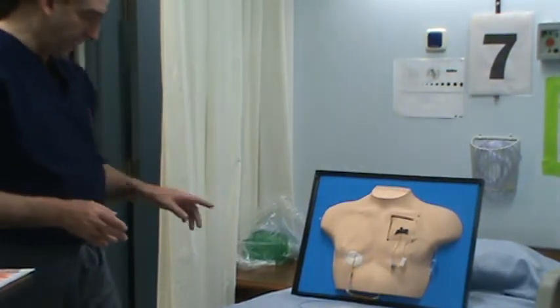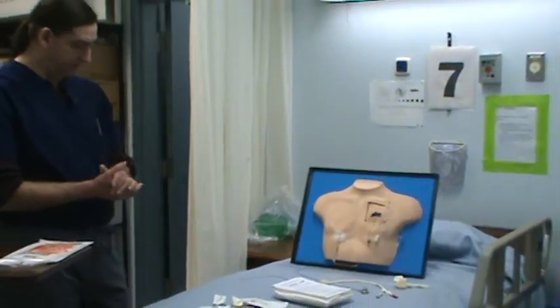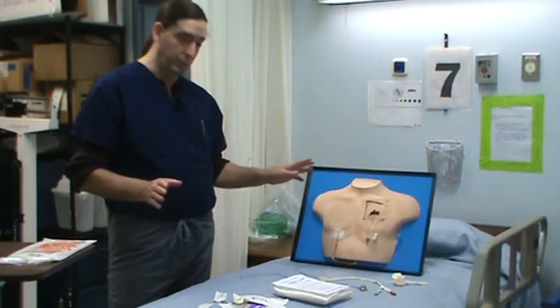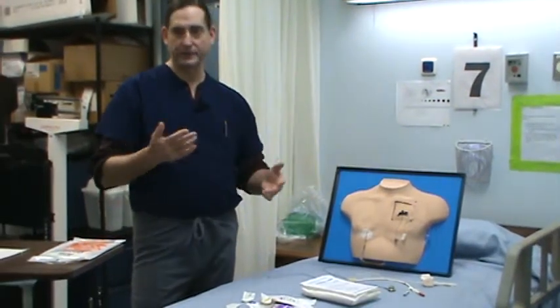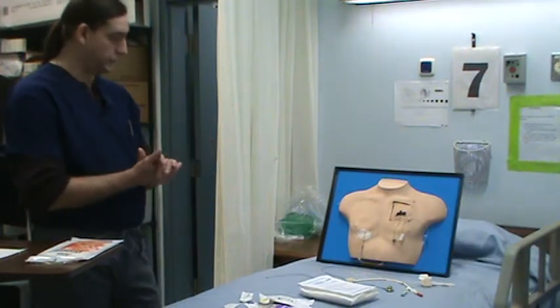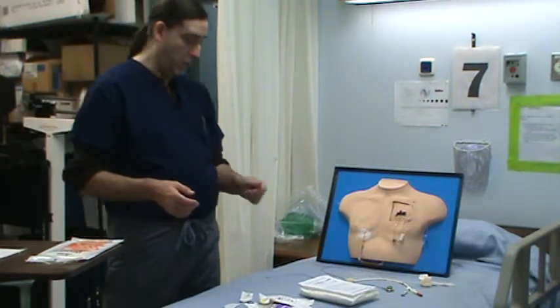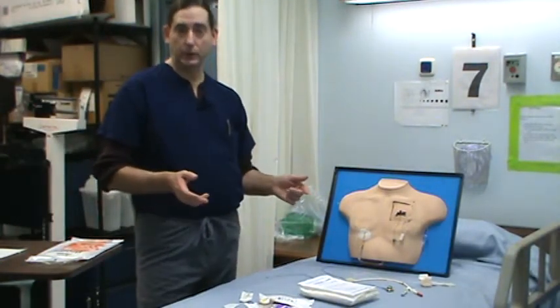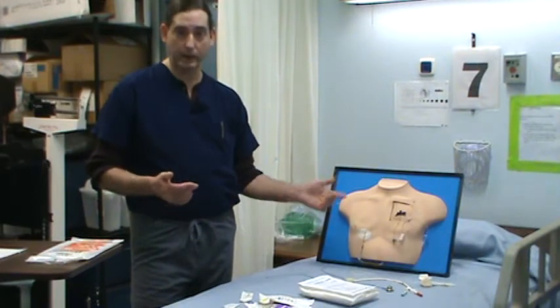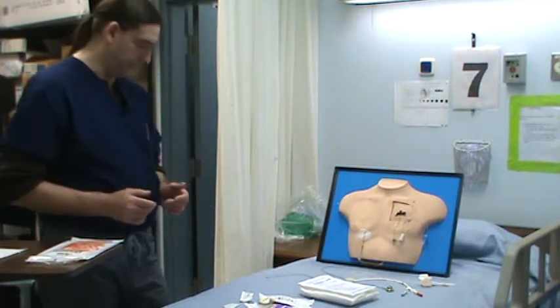Now what I have to do is change this central line dressing. So I'm going to wash my hands, because that's what you have to do. With this one, you don't necessarily have to check the doctor's order, as I said, but you do have to wash your hands, ensure adequate lighting and patient privacy. Also, just because I always do it, if I'm just starting the shift, I'm going to check my patient's wristband, just to know who I'm working on.